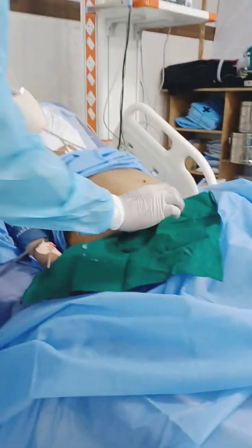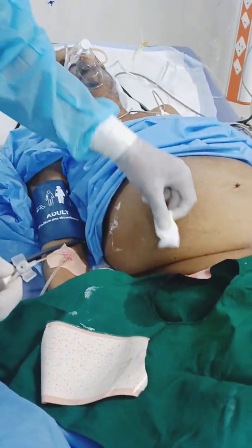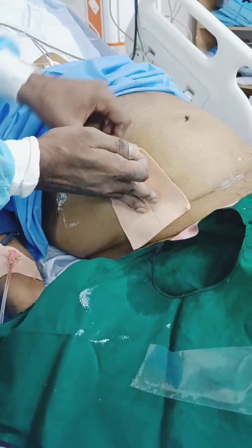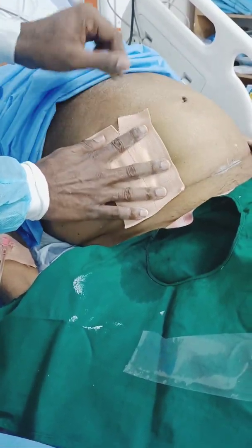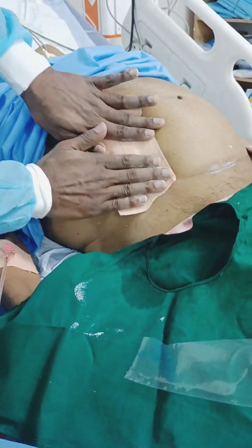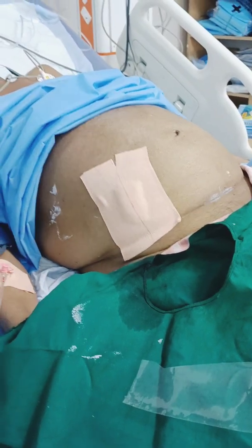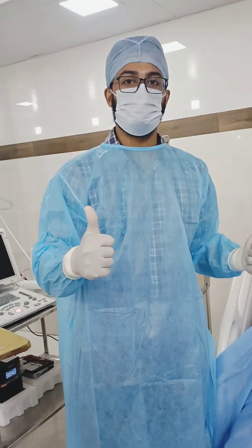In the end, remove the cannula from the site, compress the area with a gauze piece, and apply dynaplast on top. I hope you liked the video. Thank you.